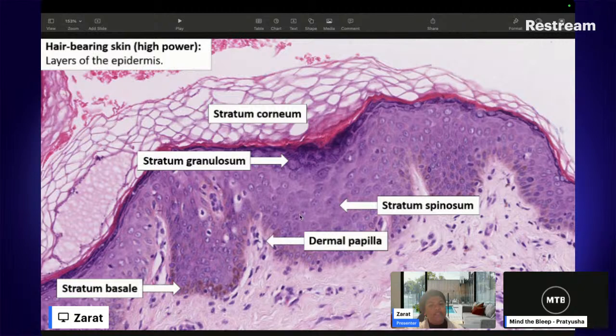Around the nuclei, they have a nice bit of plump, very pinkish cytoplasm. This is your stratum spinosum, the spinous layer, where the nice, young, fresh, vibrant keratinocytes like to hang out. I'll show you in a bit a more detailed picture of why it's called the spinous layer.